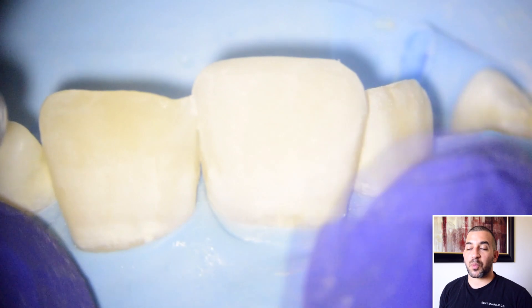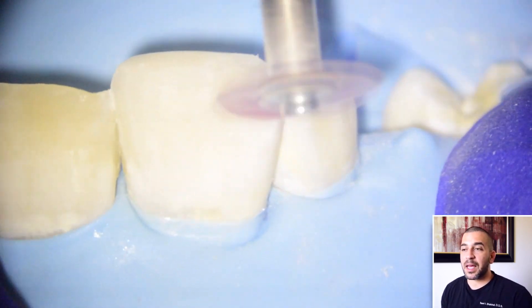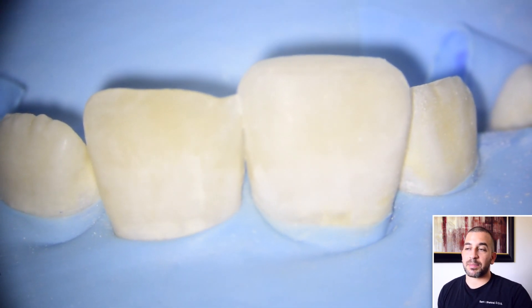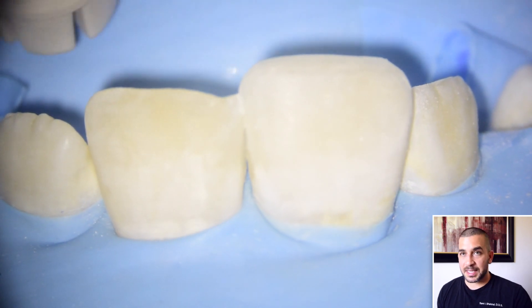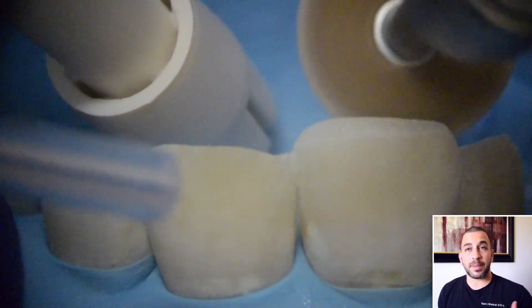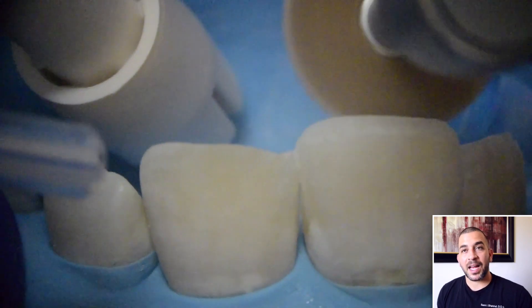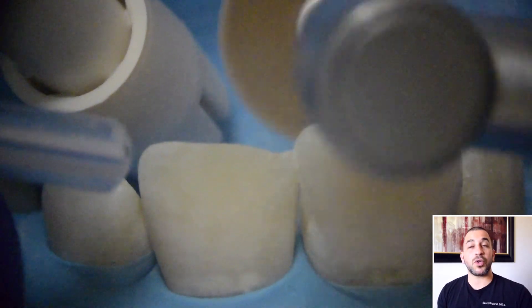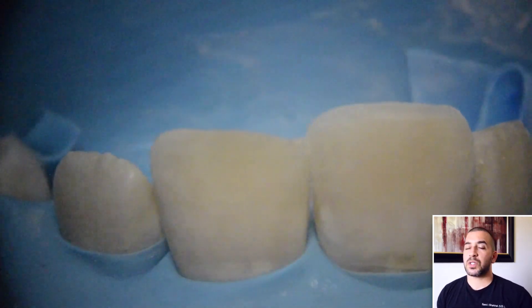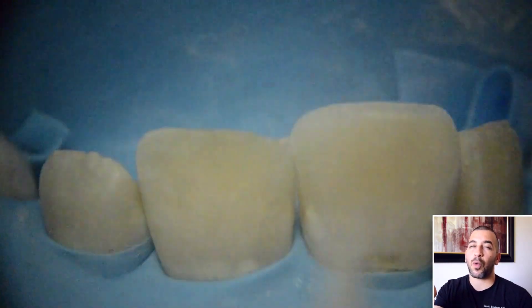With kids it is hard to determine where the final incisal position is going to be. The reason I added length to him is because I know that he's worn his teeth down from his original position. I can tell you that after this whole set was completed I reduced it about another millimeter with my discs. This gives you an idea of how we can create length with composite resin, and I would always err on the side of being a little bit long — because you can always cut back at the end of the procedure, but if you don't add enough early on then you're stuck with the position that you finished at. So it's important to get the length as close to where you want it as possible, or just a little bit longer, so that when you're finalizing the procedure you can cut back to wherever you want to.